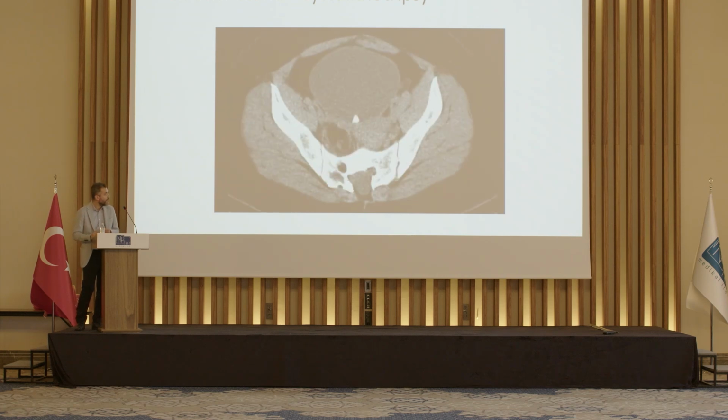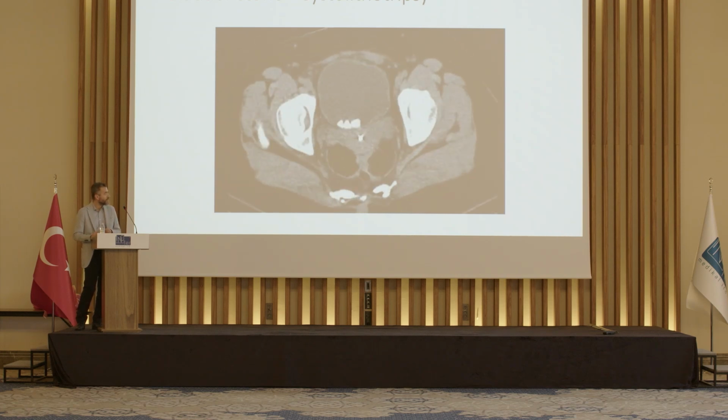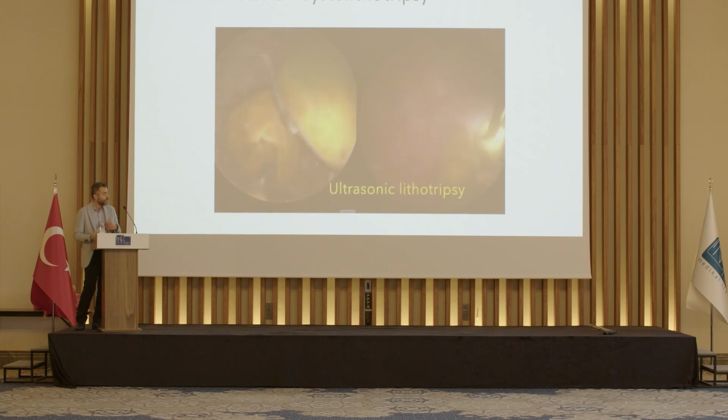This is a bladder stone, multiple stones inside the bladder. So just to show both ultrasonic and ballistic, this is the ultrasonic one. You see it also fragments. You don't need to suck out all of them. You just fragment. At the same time, while doing fragmentation, it sucks out the dust. But in the end, you can also fragment with your ultrasonic and take those pieces out.